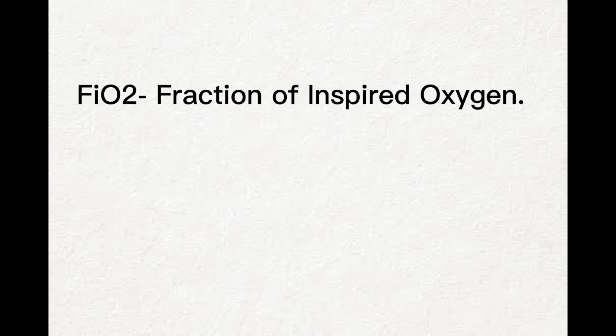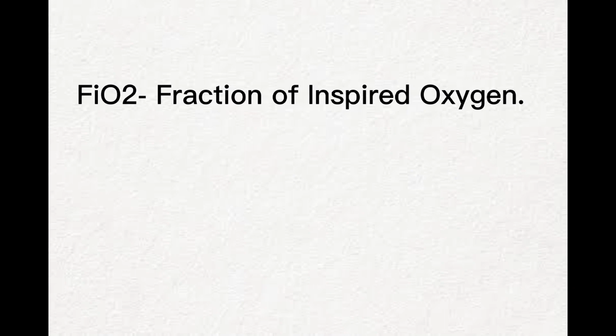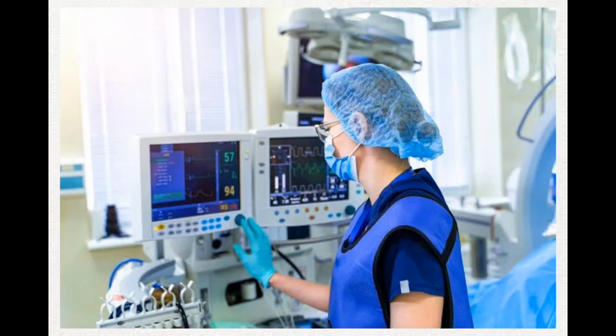The next on our list is the fraction of inspired oxygen, FiO2. Some people call it fractional inspired oxygen. This is the concentration of oxygen in the air mixture or gas mixture, whichever way. Whenever we breathe in room air, we don't breathe in pure oxygen. We breathe in air, and from the lungs we take in the oxygen and take out the CO2. So for a healthy human being, we breathe in 21% FiO2.